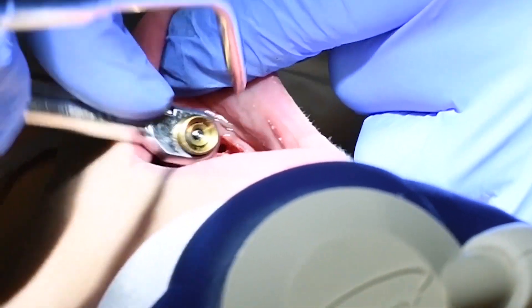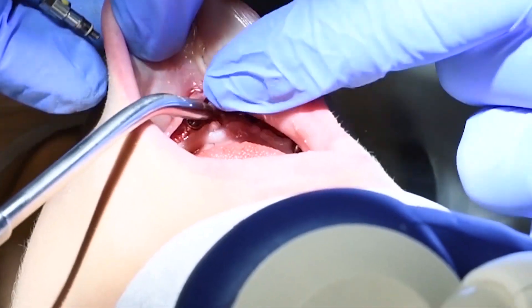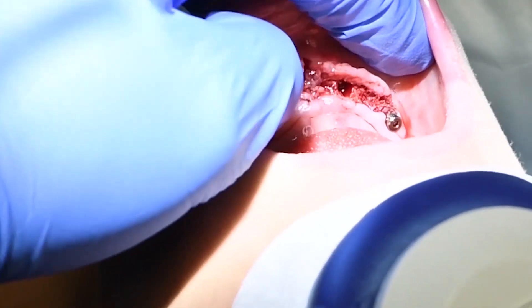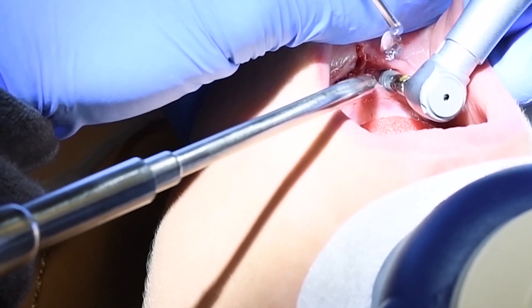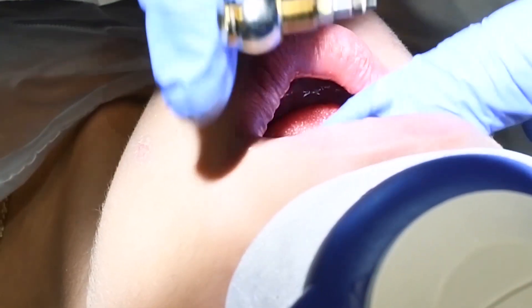Now I can go ahead and place the implant. I'm using a torque wrench after the initial handpiece. Note that you can see that blue nasal hood — we're doing this under nitrous and local anesthetic, so the patient is awake and aware. This ratchet makes a little clicking noise and we just ratchet the implants into position, getting both in place.